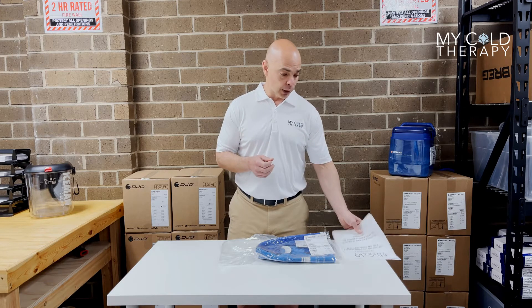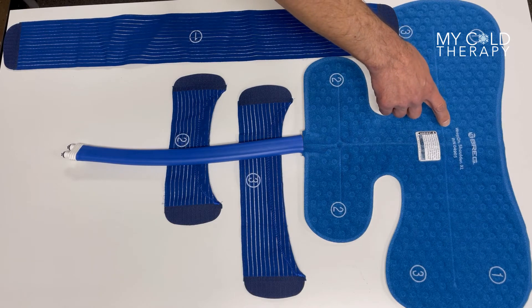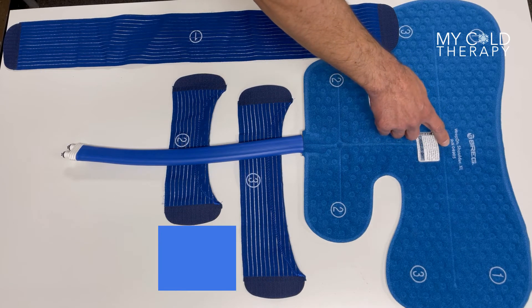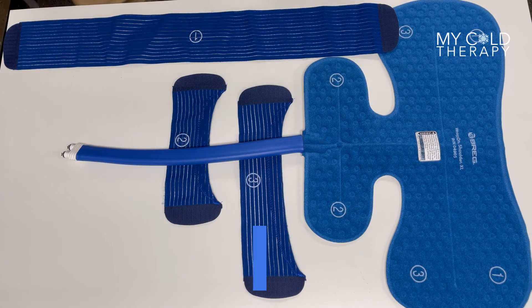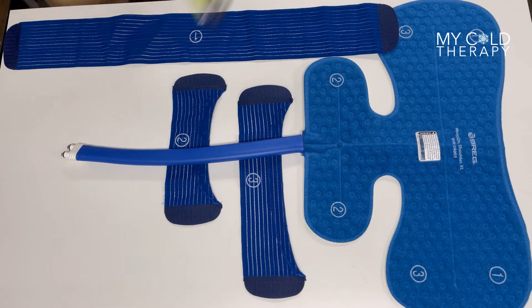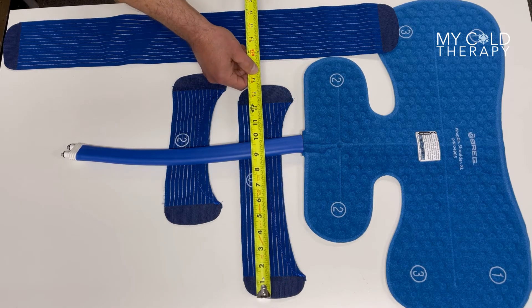As we continue, we're going to go through the dimensions of the straps and the connectors to show you exactly what we're talking about. On every Breg pad it's going to say the part number on the front — this is a Breg wrap-on shoulder pad XL, part number 04905. This particular pad comes with three straps: strap number one is 30 inches long, strap number two is 10.75 inches, and strap number three is 14 inches.